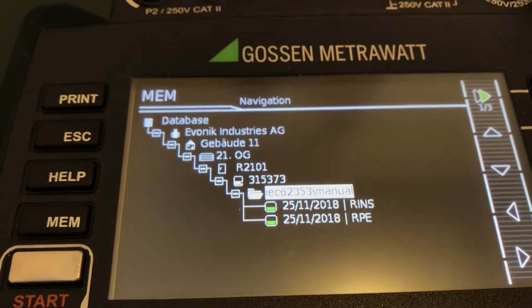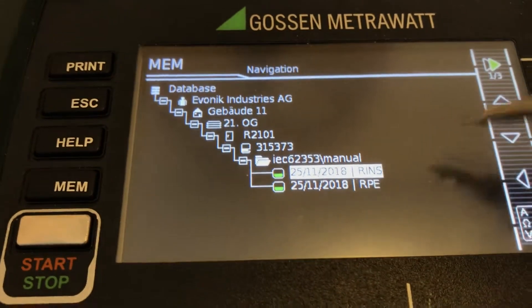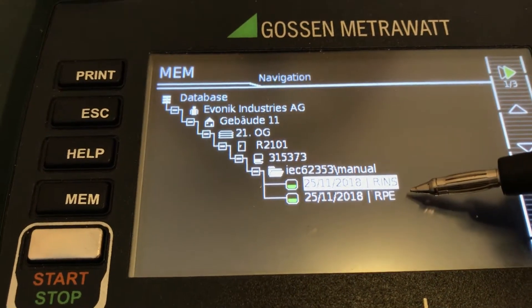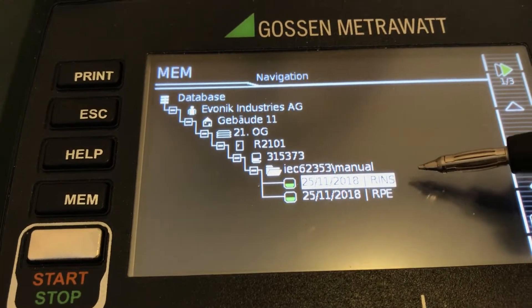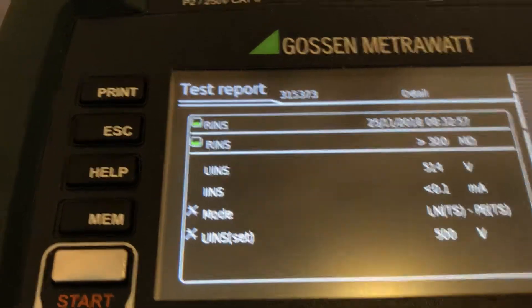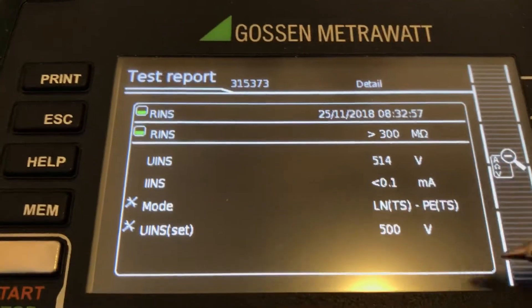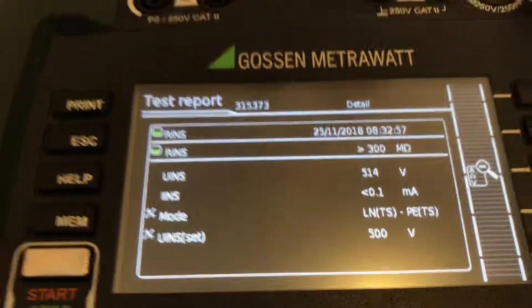We can also store a single measurement. In our case, we have done an insulation measurement, an RPE measurement, a ground protect measurement, and an isolation measurement. If we want to see this scenario, we just open it and get the background information of the device itself.